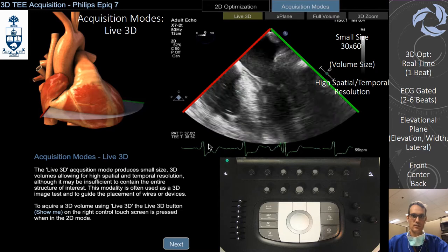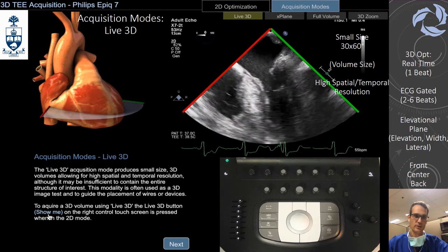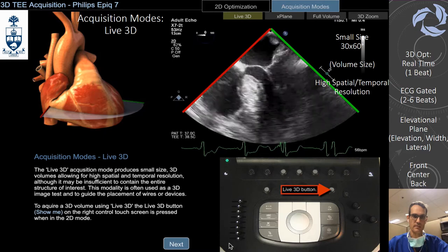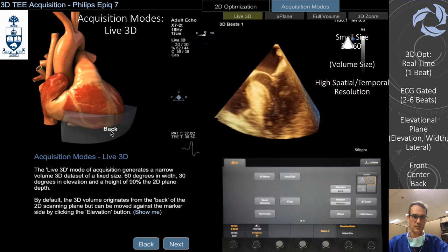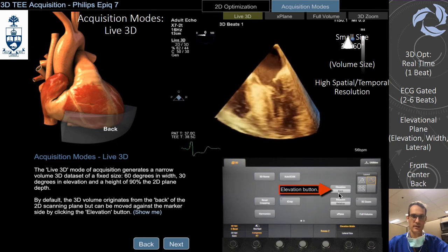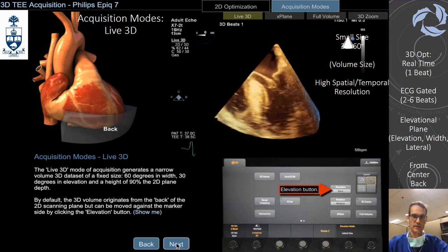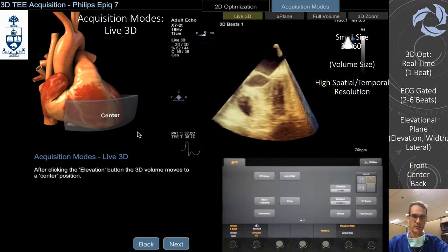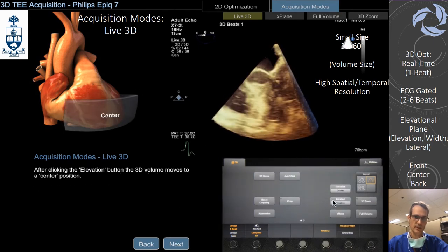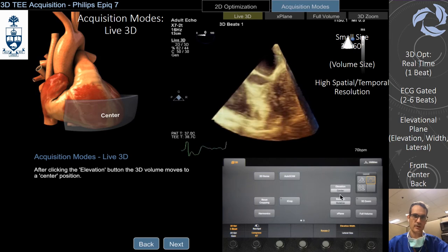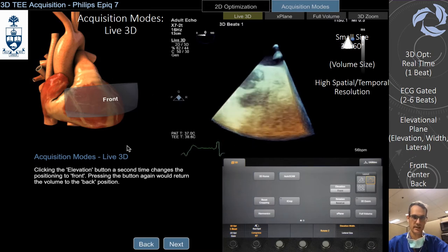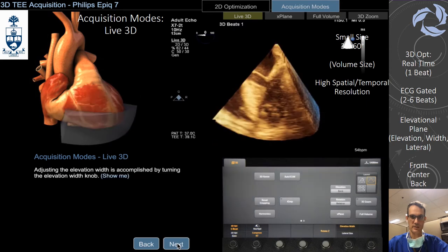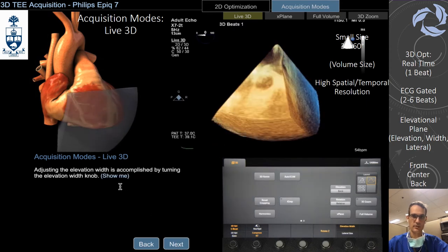The second acquisition mode for 3D on the Epic is Live 3D. The important aspect of Live 3D is its small size — it's only 30 by 60, meaning 60 degrees width and 30 degrees elevational. It's a real-time one-beat acquisition, but you can gate for up to 10 more beats retrospectively. You can adjust your elevational planes — front, center by default, or back — and you can do lateral to give a wider image.